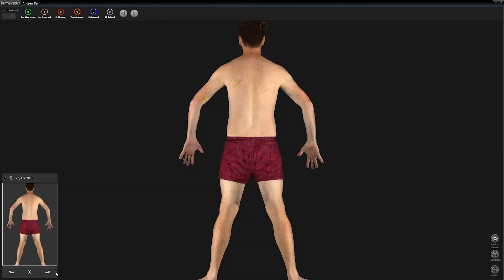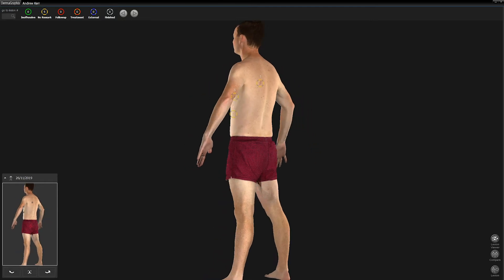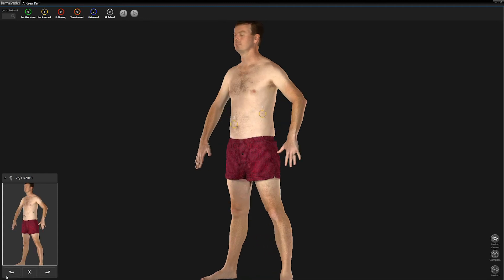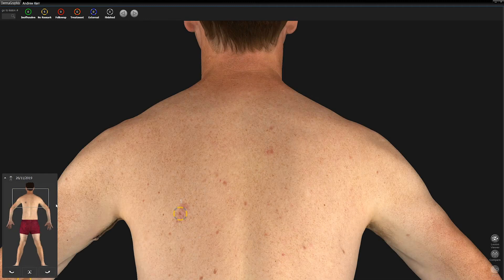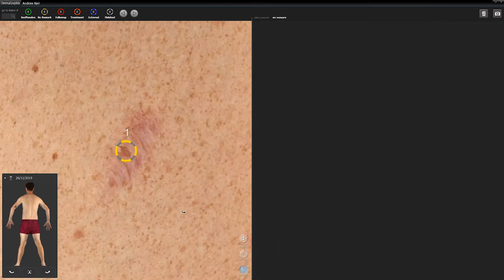It is important to note that you will not be able to assess the scalp for patients with hair, or the soles of their feet, on the 3D body map. The presence of blue or yellow circles or markers over a lesion indicates that a dermoscopy image is available to view. To view the associated dermoscopy images, click on the circled lesion.